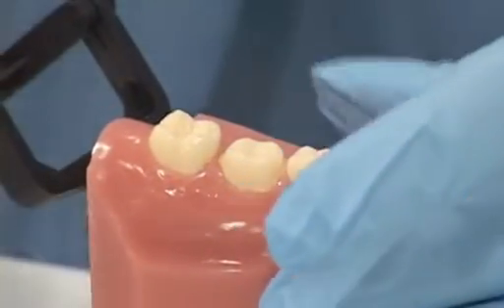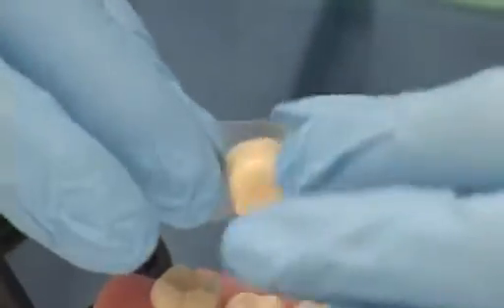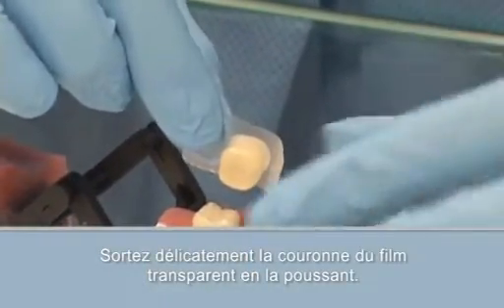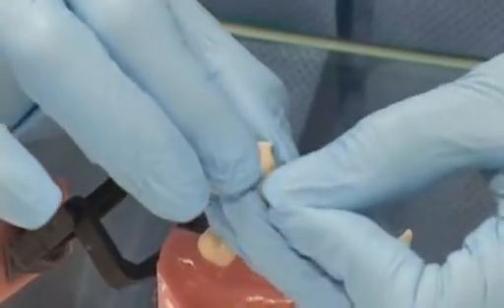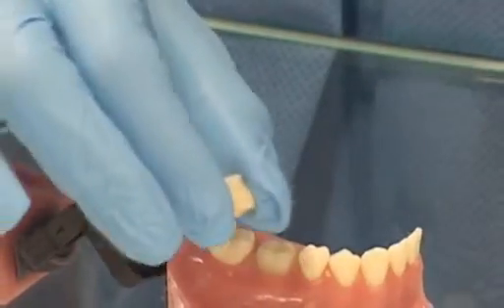So, next thing we're going to do is I've got my little package here, and I've already opened it up. If you just take the corner and open it up, it actually comes in this little sealed container here, and this is really how it looks. The first thing I want you to know is that you don't want to just arbitrarily grab this and push it through. I want assistants to understand that this is really just made out of composite, so you really can take it and crush it in your hands if you're not careful. So we easily and gently want to push the crown through this little plastic piece here. Because remember, I can actually distort this in my hand, so I'm going to put that to the side.